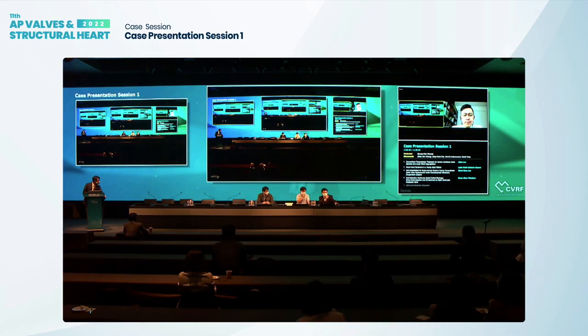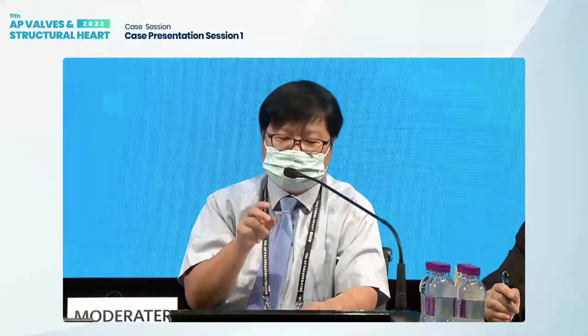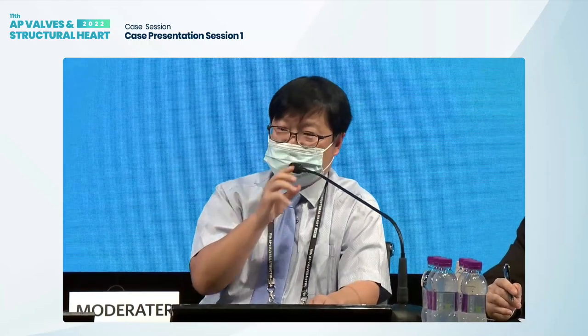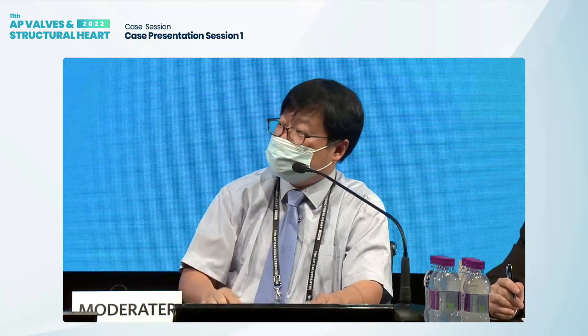Okay, I have a question for Dr. Lee too. How much time did it take for doing TAVI and TMVR together? Maybe 3 hours. Yeah, 4 hours. Actually, we had two simultaneous cases of TAVI and TMVR in our hospital. Both patients had double valve replacement, and doing TAVI first or doing TMVR first is a concern. So in your case, why did you do TAVI first and TMVR next?